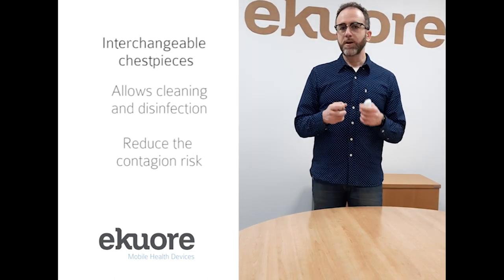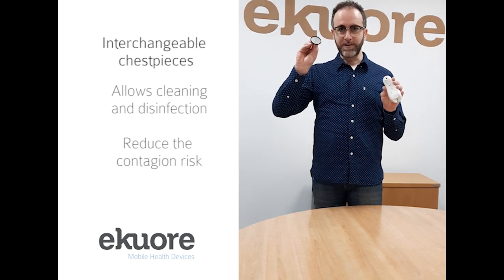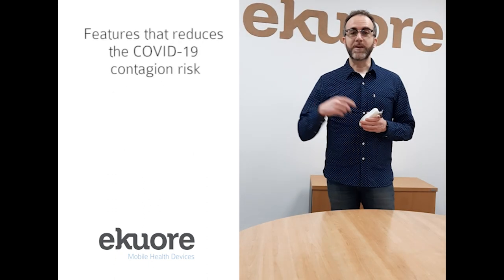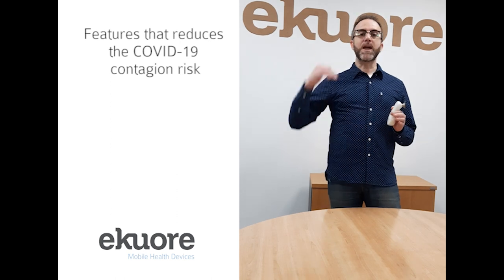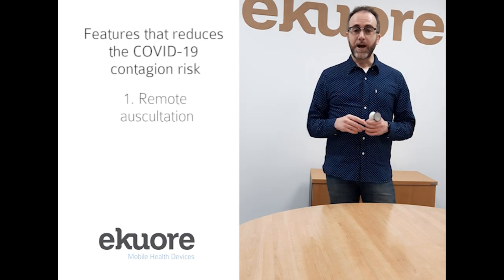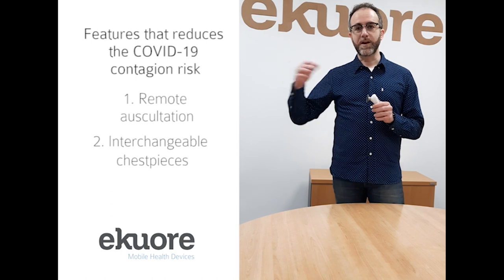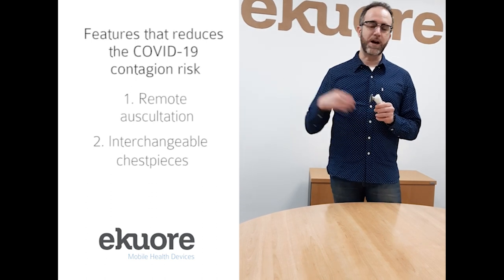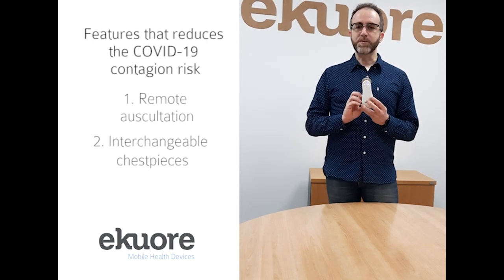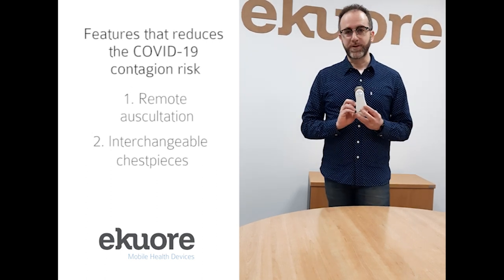You can replace them, you can clean them — you have the option of just taking this piece out and cleaning it aside. Therefore, with these two features — being able to auscultate from a distance and being able to interchange the chest piece and clean it after every patient use — this EqualPROD is very useful for this situation and to avoid any risk of contagion.